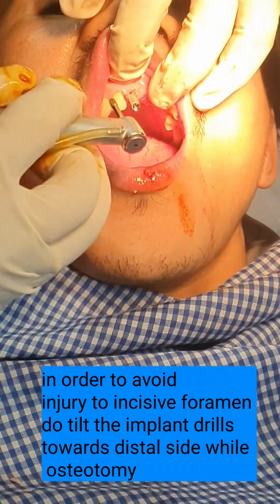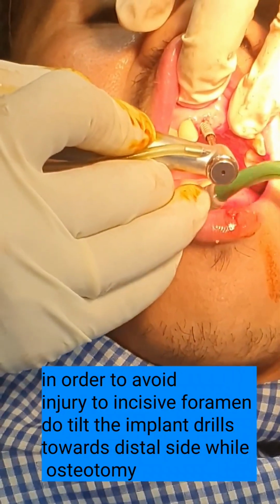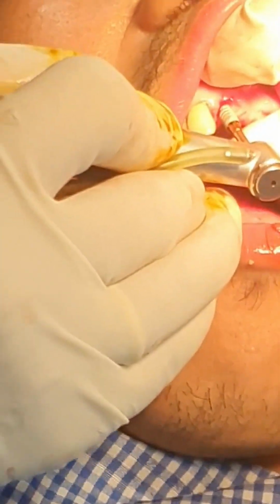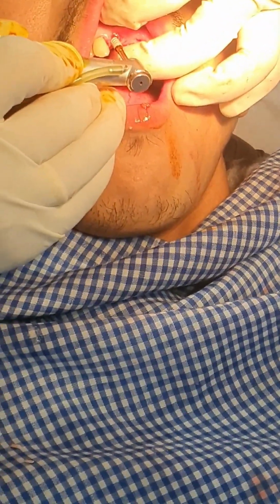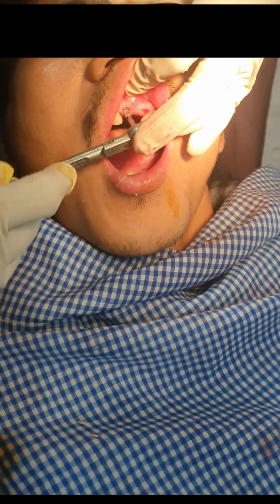While placing, you can see that I am doing the procedure blindly. I am placing a blind dental implant. I am not raising any flap. This is because the patient was diagnosed with typhoid, and he has just completed his medication 10 days back. Also, we have asked for the reference from his doctor. He has cleared the reference and said that we can proceed with the dental implant surgery as all the blood reports were normal.